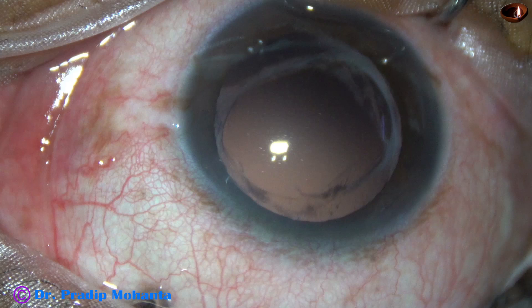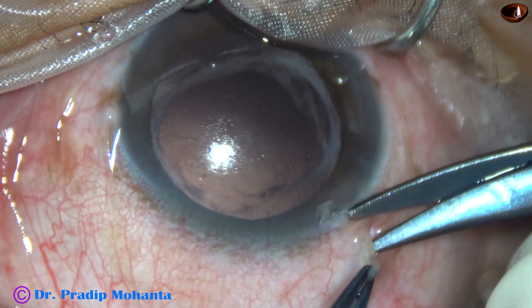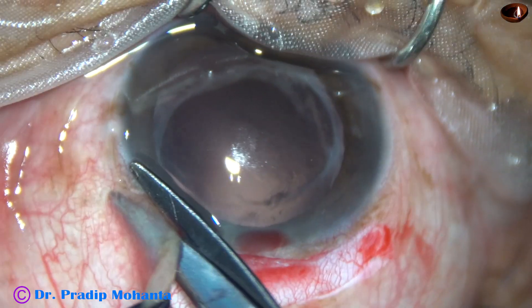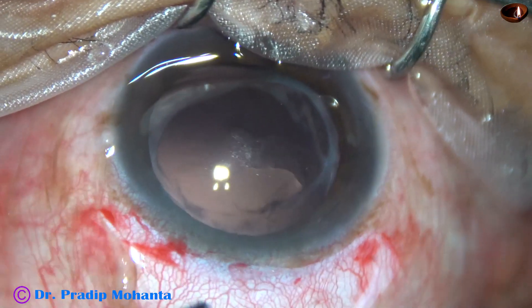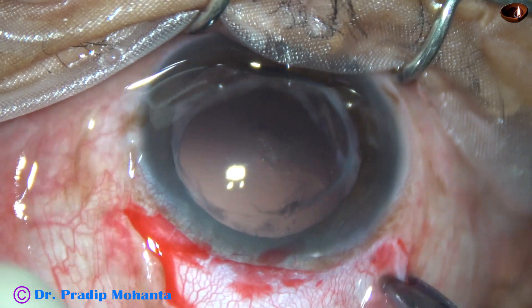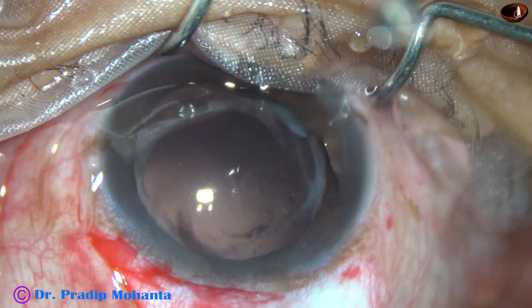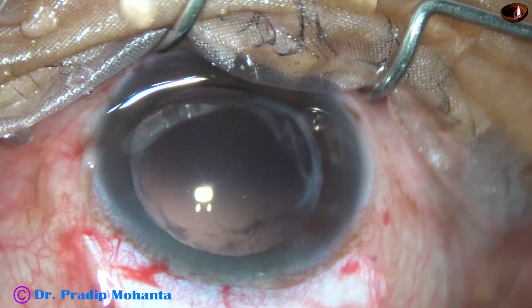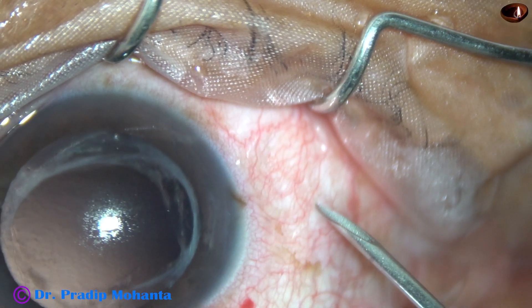Friends, the intraocular lens has dropped into the vitreous cavity in this case. Let us see how we can treat this patient. Conjunctival peritomy has been done for about 4 o'clock hours. Now mild wet field cautery is done — very mild cautery without causing contraction of the scleral surface.